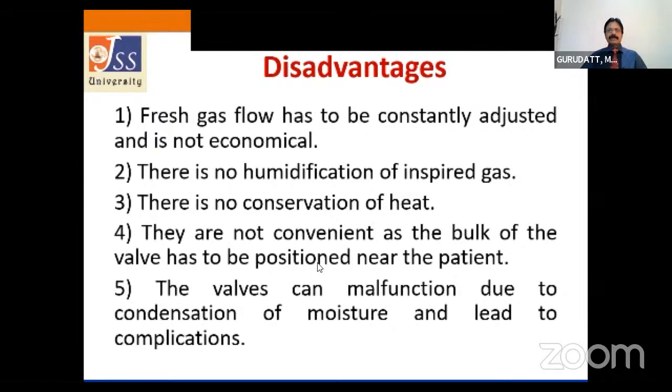And they are also not convenient because they have to be close to the patient, and the bulk itself can produce drag on the endotracheal tube. And many times they can malfunction, and once they malfunction, it will be a disaster for the patient.